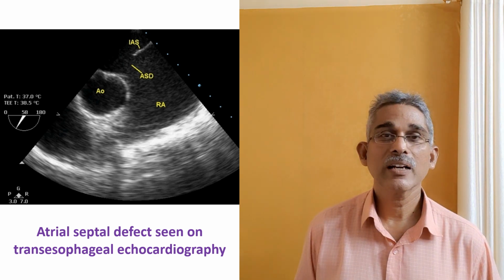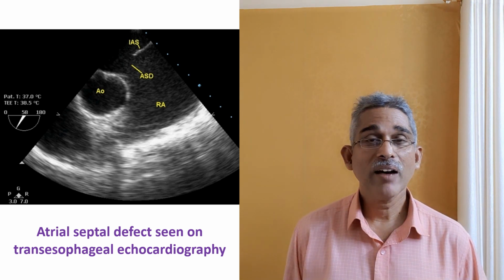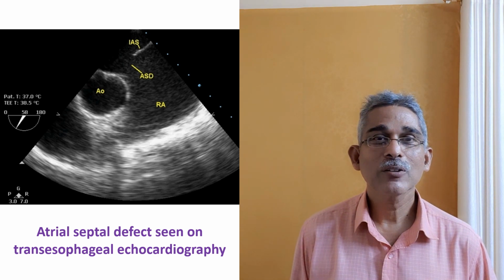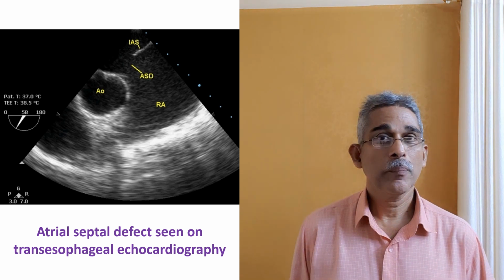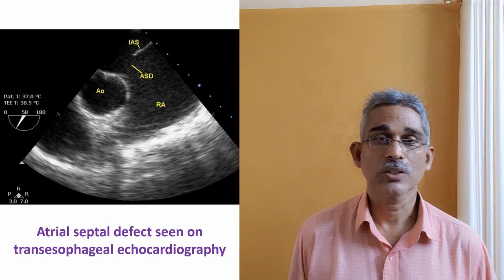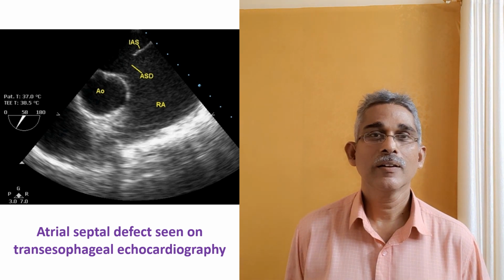So several advantages are there for transesophageal echocardiography. The only disadvantage is that it is semi-invasive and the operator has a higher learning curve. You have to have some experience like an endoscopist, and a patient may gag or rather retch when it is done under conscious situation. In intraoperative use, that disadvantage is not there.